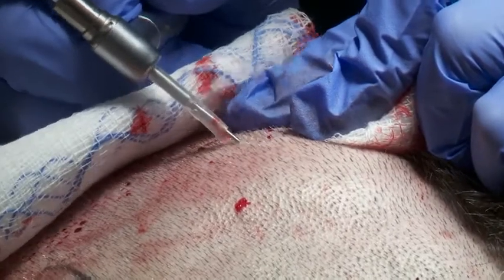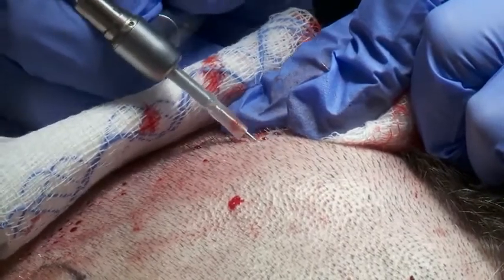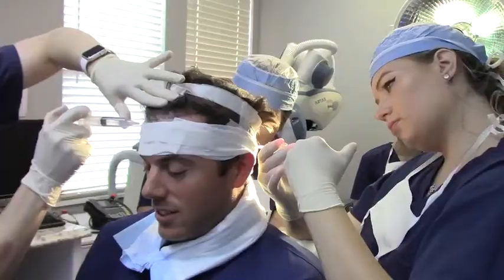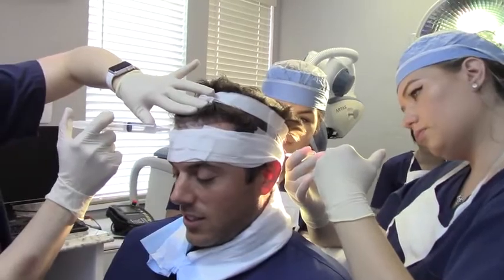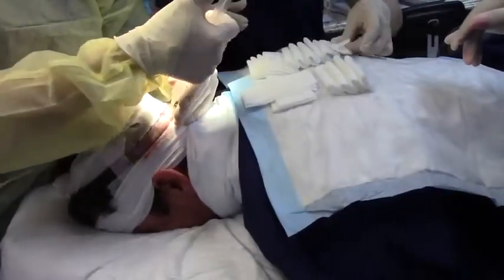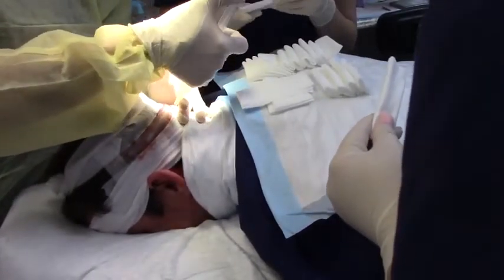An FUE procedure, whether done with a Neograft device or not, often results in a little bit more visibility in the donor area immediately post-operatively. The patient may get a headache the night of the procedure or a day or two after. All transplant procedures have the risk of some swelling in the forehead, and you will feel a little bit of discomfort whether it's an FUE or an FUT — a linear procedure — when the patient is being numbed, because you do use some needles along the front and along the back of the head.